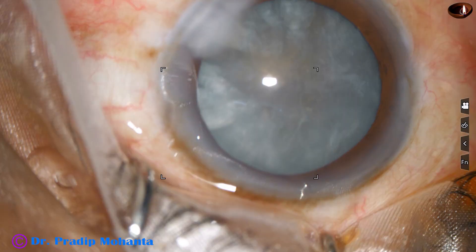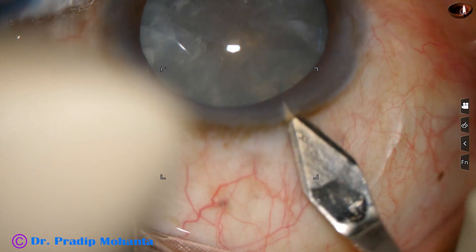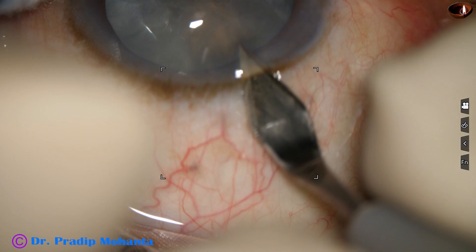Can we guess how hard this cataract is? White cataracts can be soft, can be very hard. Let us see how this cataract is.